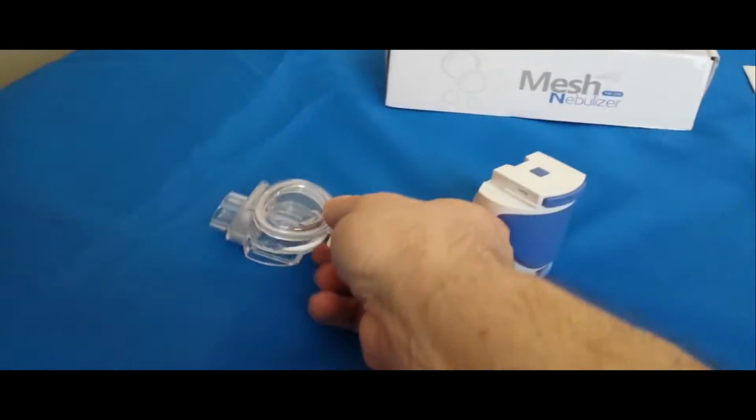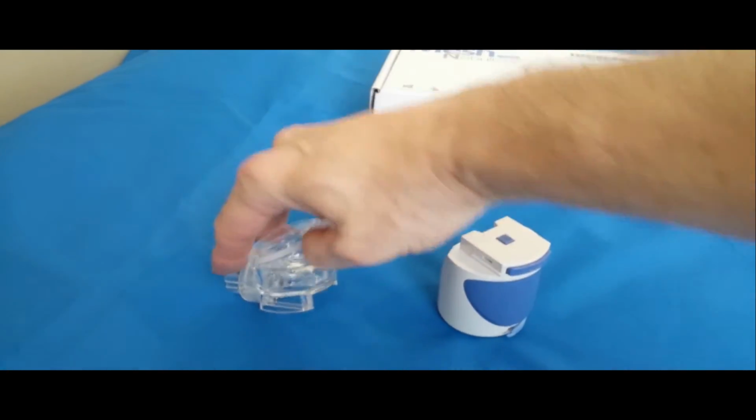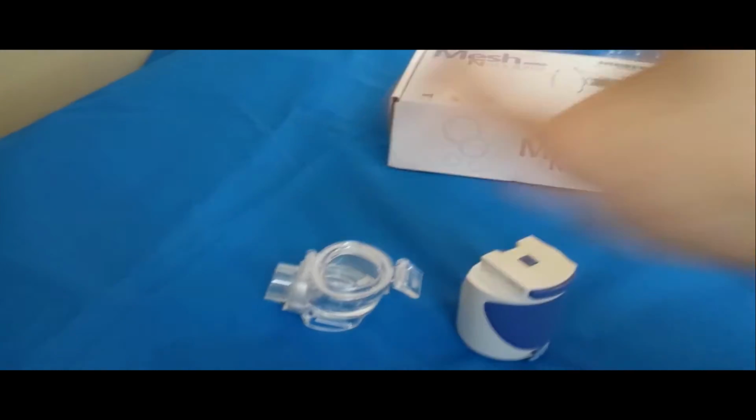And then to rinse it off, you pop that up, pull this over, and then you can dump out the formula and rinse it off to keep it clean.